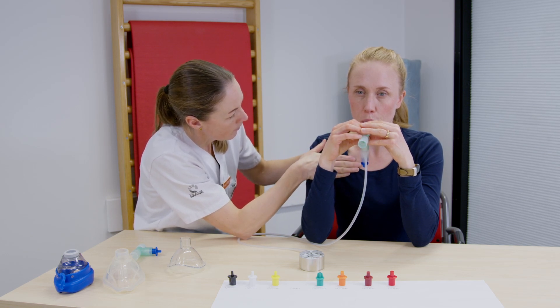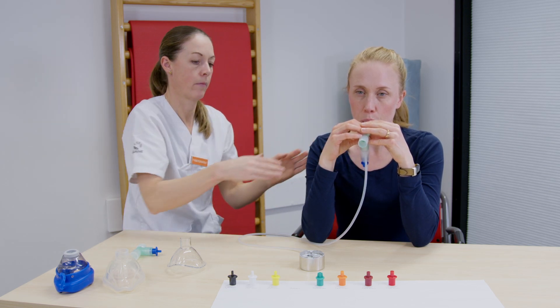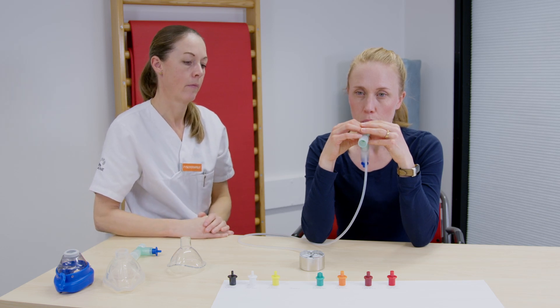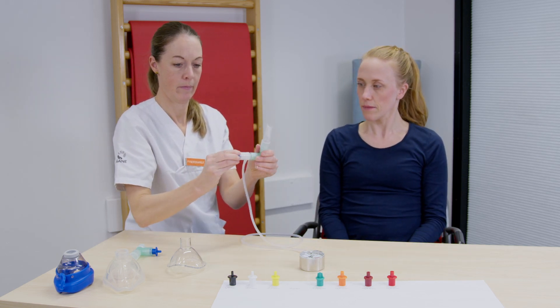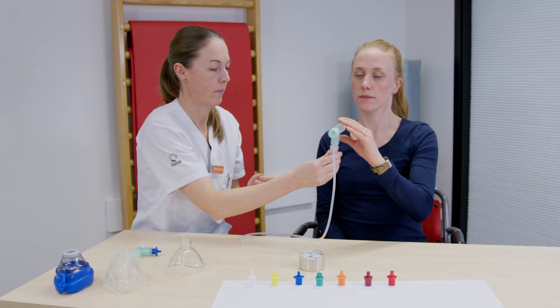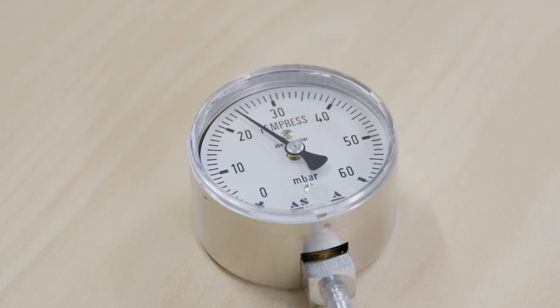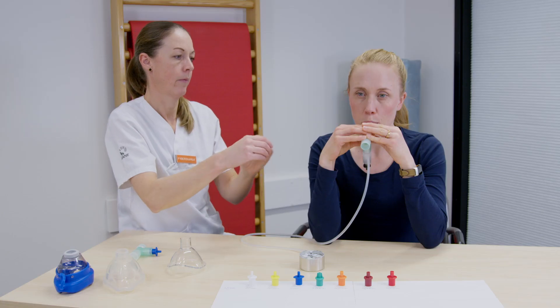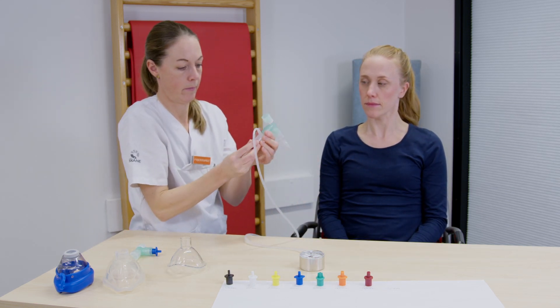Patienten ska också se bekväm ut och orka andas tio andetag i följd. Om patienten gör på det här sättet kan du bedöma om motståndet är korrekt. Ibland behöver motståndet justeras. Att byta till en mindre öppning i det färgade motståndet ger ett större tryck om patienten andas med samma luftflöde. En större öppning ger då ett mindre motstånd och lägre tryck.